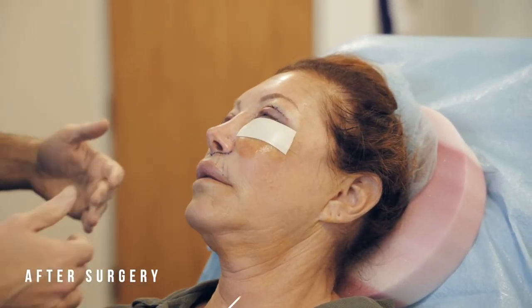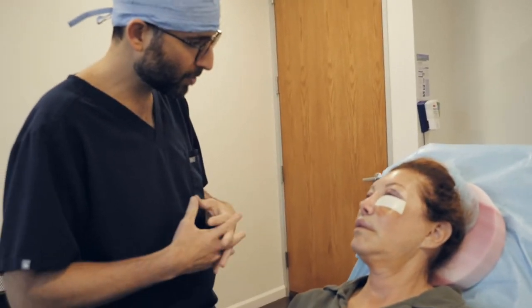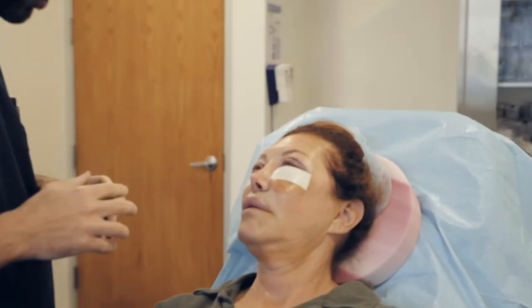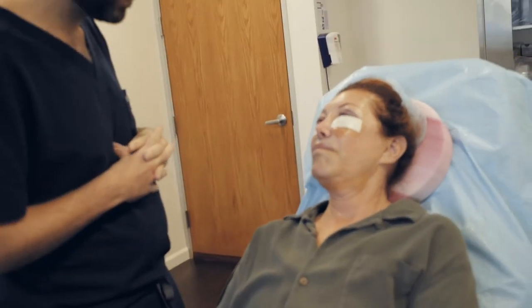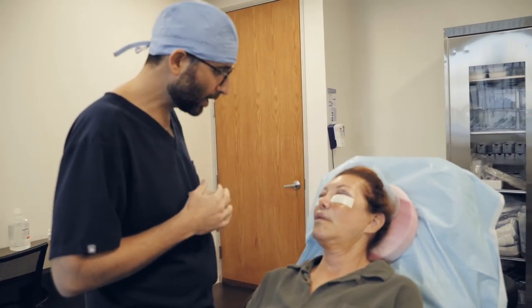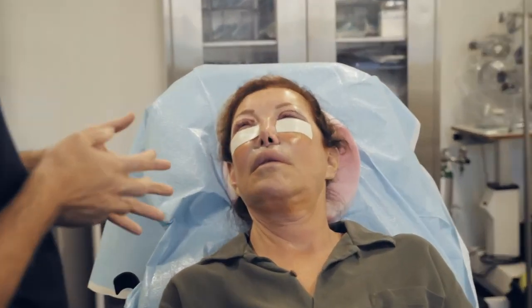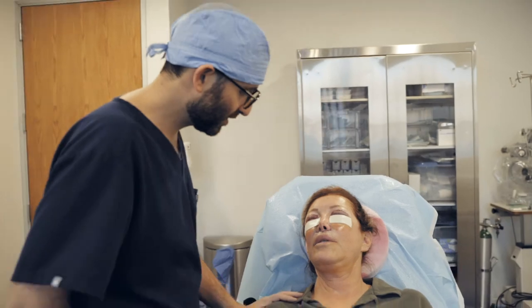And there is your lower lid fat repositioning — fantastic. You've got a couple of little tapes on that will keep the swelling down. And your lip lift looks beautiful — you're going to have a nice cupid's bow now, and a lot more upper lip enhancement with a shorter philtrum. So it's going to be beautiful. Any questions for me? Nope. Thank you, you're welcome. Just rest tonight, don't talk a lot, put some ice on the eyes, take the antibiotics. They gave you the pain medicine. And come back in one week.